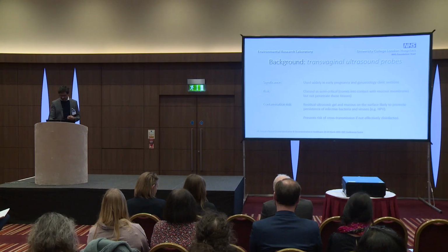And we know that these biological fluids and soils can harbour bacteria, viruses and other microorganisms, and also protect them. There is also a risk that if they're not removed effectively, they could disseminate onto other surfaces, which will then recontaminate other parts of surfaces and clinics.